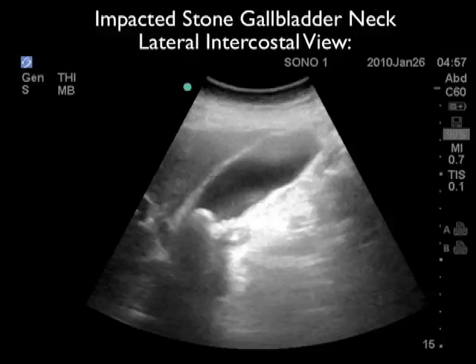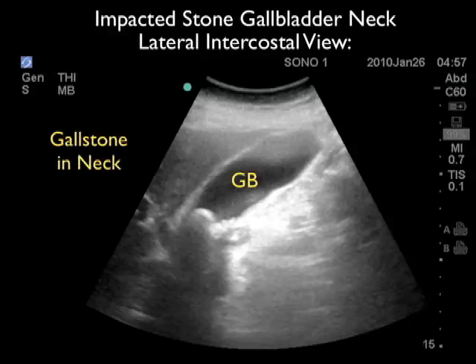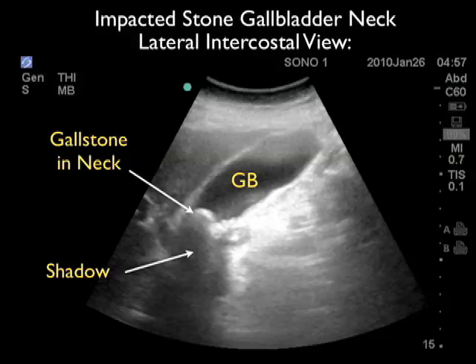Here's a still image showing the classic appearance of an impacted stone at the gallbladder neck. We're looking through the lateral intercostal view, giving a nice long axis view of the gallbladder. We can see a gallstone located within the neck of the gallbladder with the classic bright or hyperechoic appearance, and the hard shadow — the blackout of sound waves — posterior to the gallstone. Interestingly, as we rolled the patient around and inspected the gallstone, it failed to move, showing that it was impacted and the cause of the patient's biliary colic.